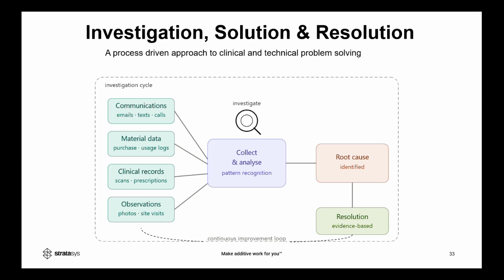Look in clinical records. One common problem seems to be bad bite scans. Improper relationship records always contribute to issues in occlusion. Then also, looking at photos, observing them and communicating them.